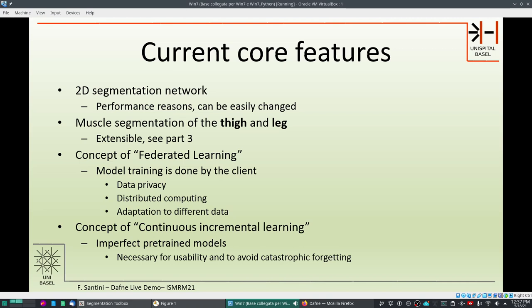Daphne implements federated learning, so model training is done by the client. You will need a reasonably fast machine to run Daphne so it can perform some small training. However, this is done on very few slices and will not require very big resources. This preserves data privacy, exploits distributed computing since we don't need huge computational power on the server, and allows adaptation to different data contrasts and formats because every user has their own protocol and specific needs.